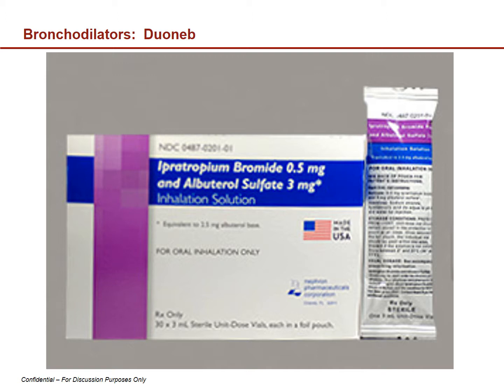Many of the medications already discussed are available for home administration with an inhaler. However, inhalers typically contain up to a month's worth of medication, and since an inpatient cannot leave SHC with their assigned inhaler, inpatient use leads to medication and environmental waste. To minimize this waste, SHC will automatically convert any ordered inhaler to the comparable nebulizer solution, frequency, and dose. Unless a patient is using his or her own medication, all bronchodilators will be administered via nebulizer.